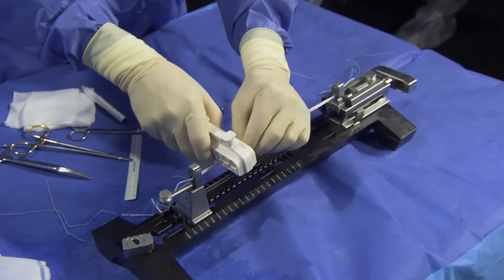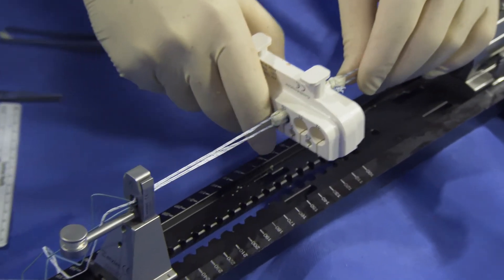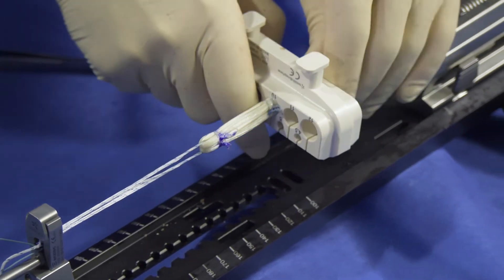Finally, the diameters of the two ends of the graft are measured snug but freely passing.